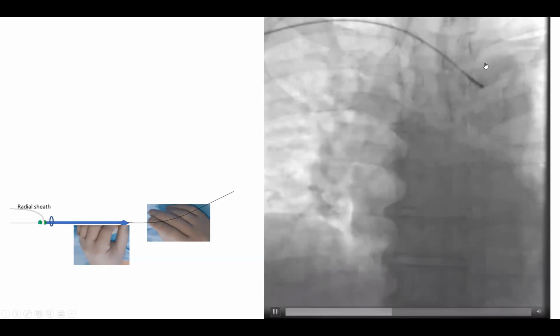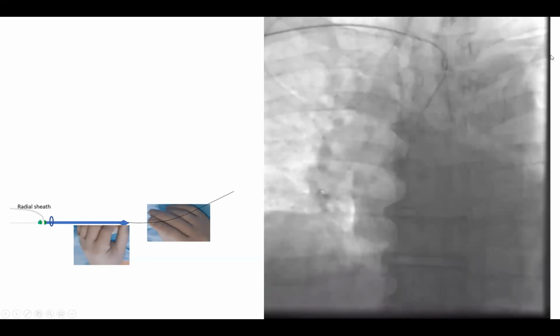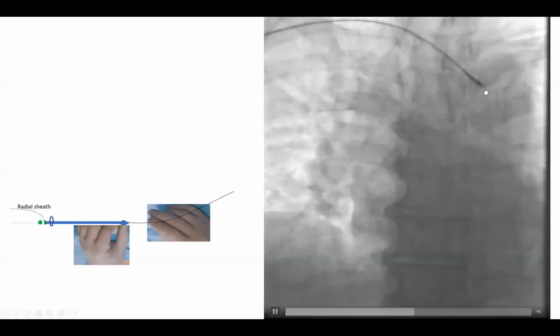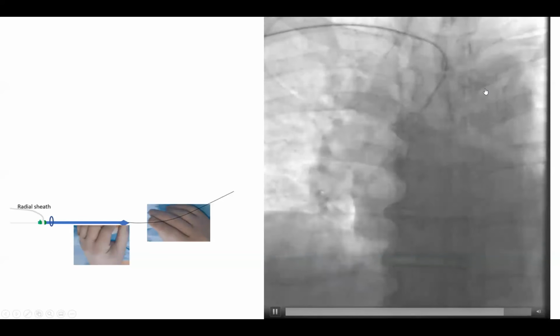So it's very easy. I see people struggle with that because they don't know the basic simple technique. That technique always takes less than 5 seconds and it always works. Counterclockwise maneuver. You pull with a counterclockwise maneuver.